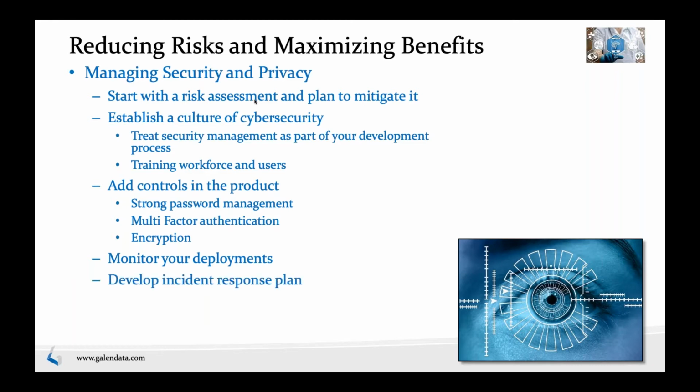And then develop an incident response plan. So what does that mean? If there's an incident, and you'd always assume there'll be one, because the chances of one happening are there, you always want to have a response plan upfront, and you want to train on that plan quite often. Again, you can start with the cybersecurity framework from the National Institute of Standards and Technology. They have a framework defined on what should be part of a response plan.